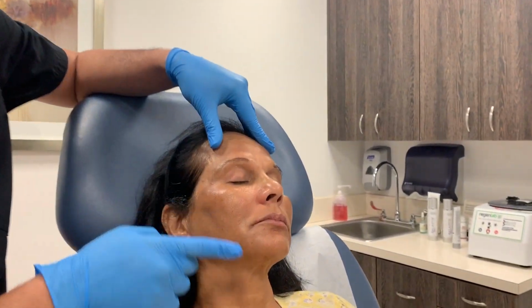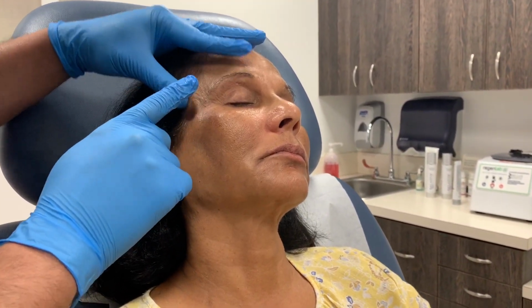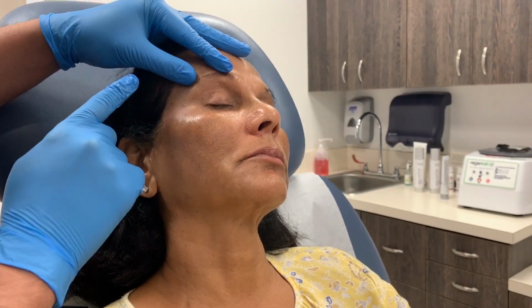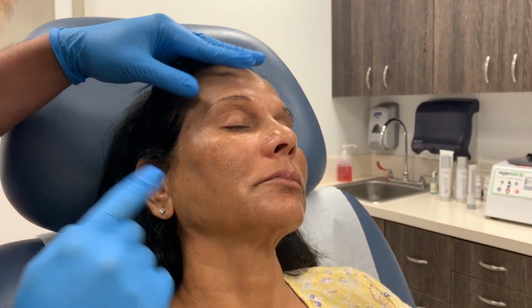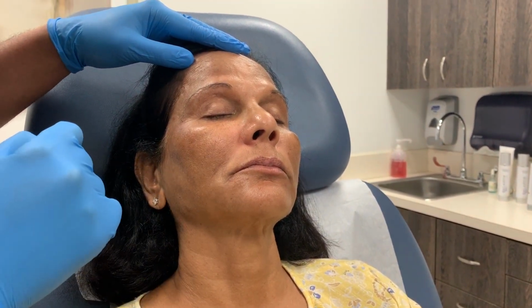If you look here, the goal of treatment is, if you see the little give in the tissues, I'm going to treat some of this volume loss here and in the temples. I'm also going to try to raise the brow, and then I'm going to open up her eyes with the Dysport around the eyes, relaxing this orbicularis muscle. And we're going to treat the nasolabial folds with Restylane Refyne.